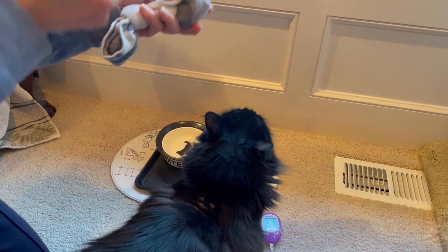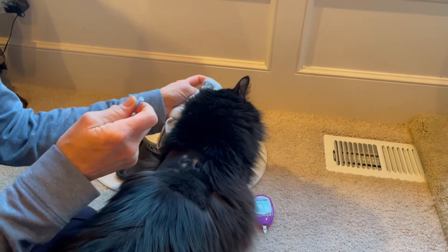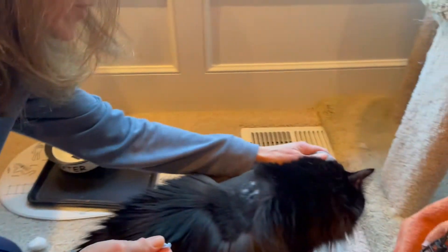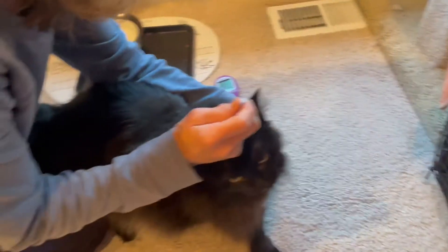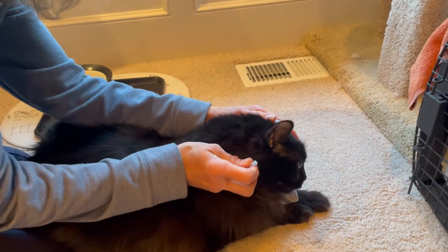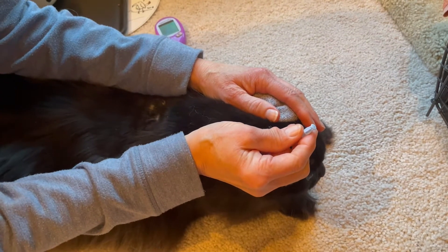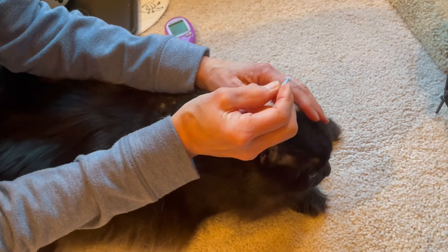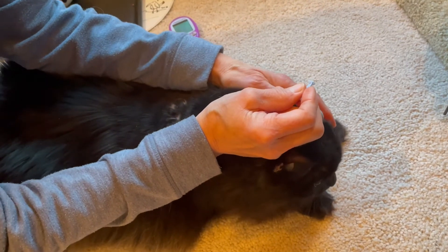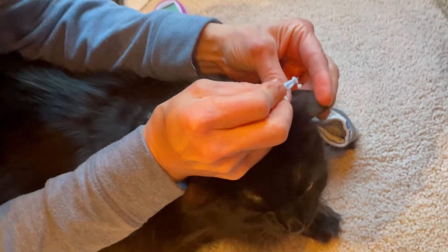This is a sock with rice in it that I've warmed in the microwave for about 20 seconds, and I'm just going to hold it over her ear. This makes the blood vessel easier to see. Okay, and there's a little vein that goes along the edge.